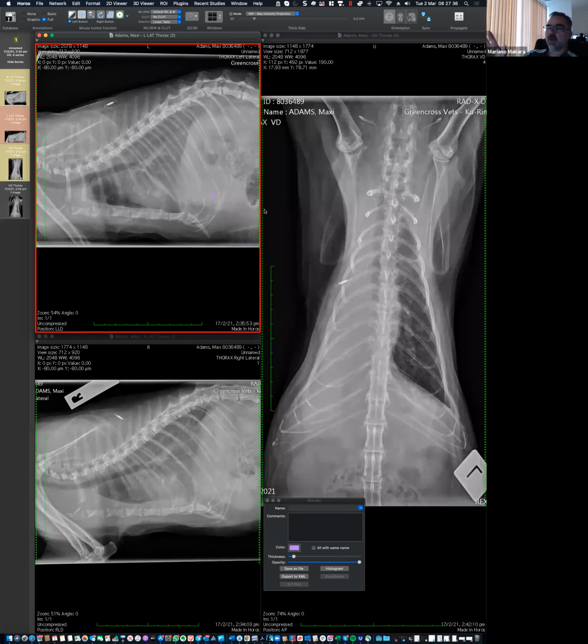So I guess now we can either have someone attempting to give an explanation, or otherwise I may take a note and come back to that later, but it may be a good time to start trying to explain. So this is a lot of hypotheses one after the other. Makes sense? Because again, the findings are very small. They're important, but it's not a long list.